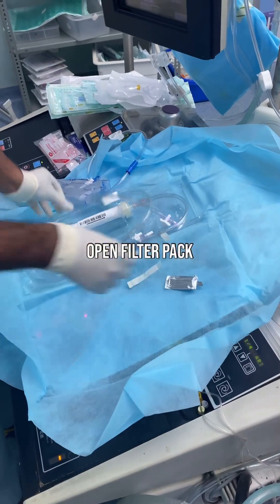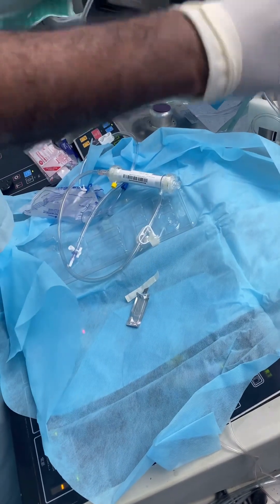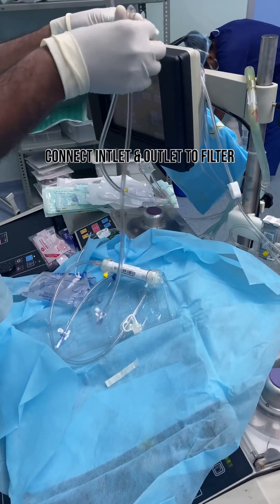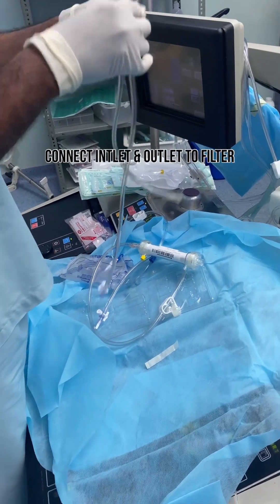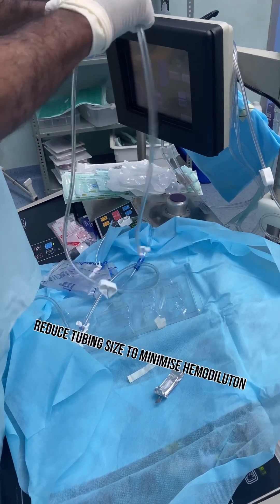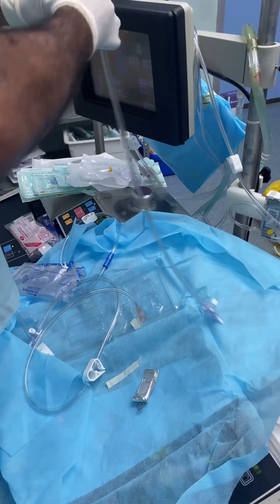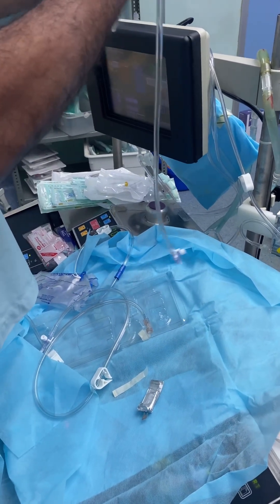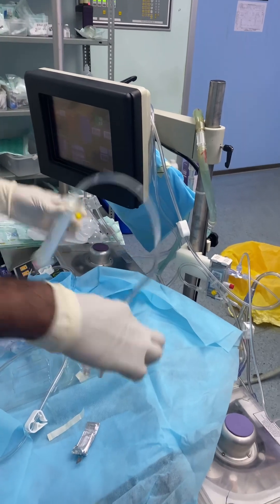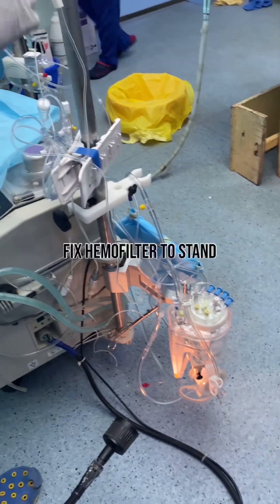Open filter pack and remove the inlet and outlet of the filter. Reduce to the appropriate size according to length. Connect inlet and outlet to filter, then connect to the first three-way port. Fix the hemofilter to stand.